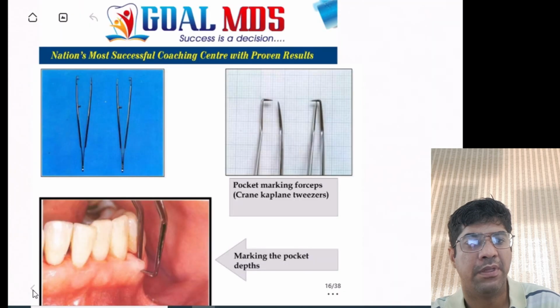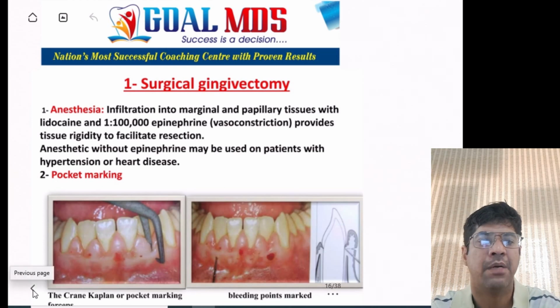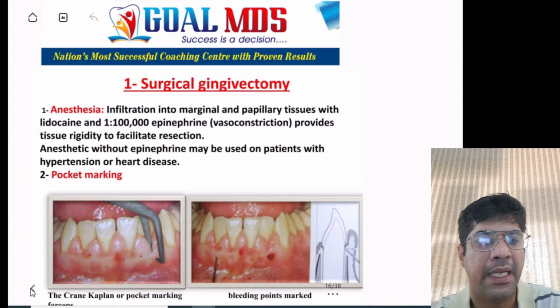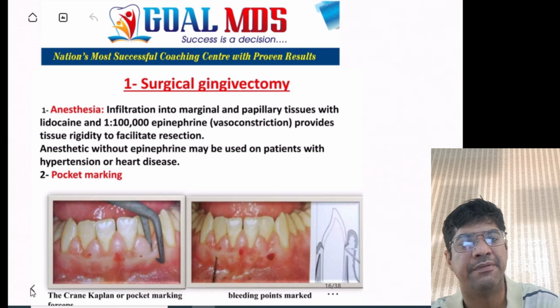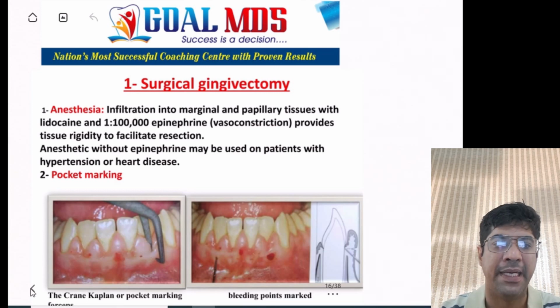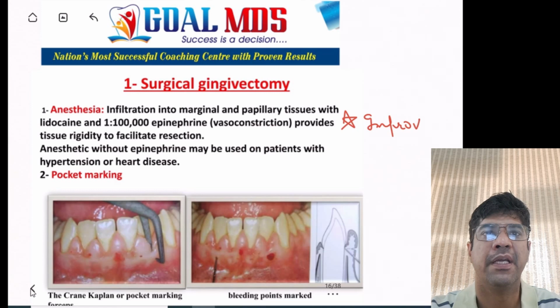This type of incision will help to remove the diseased or excess gum tissue while ensuring a smooth transition between the treated area and the remaining gum tissue. Creating a bevel incision at 45 degrees during the gingivectomy procedure can serve various purposes. It helps to minimize the trauma to the tissue edge, promoting better healing. The angle of the bevel reduces the tension. So number one is improved healing.